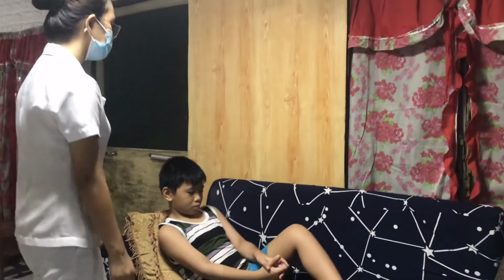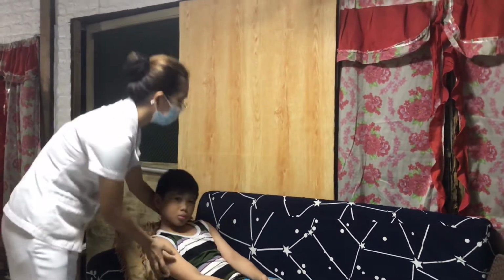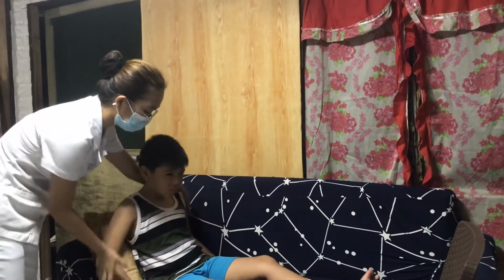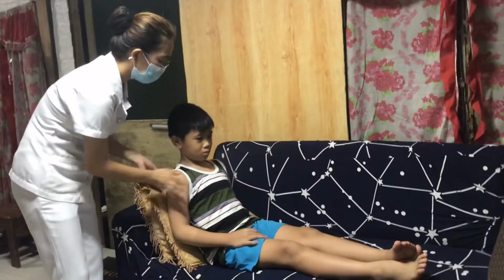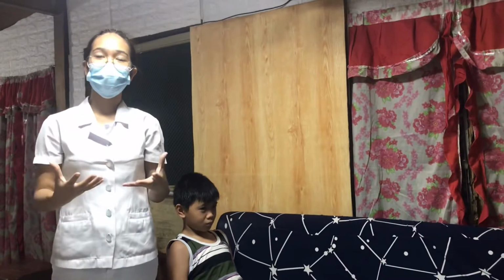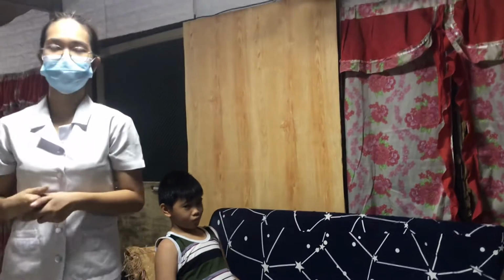Hi again, sir. So for today, can you relax this one, sir? Because I will be injecting the medication from this side. Okay. All right. After that one, apply a clean glove and use an antiseptic swab for the injection site.